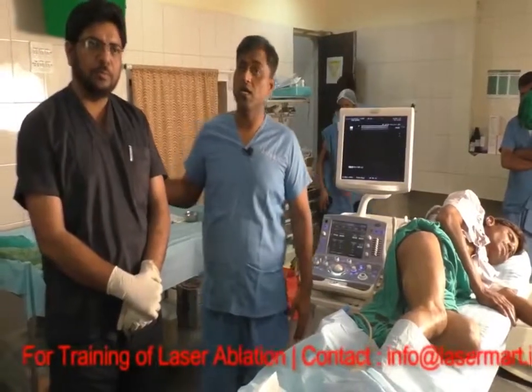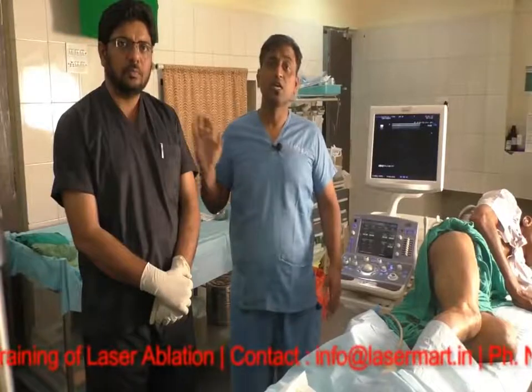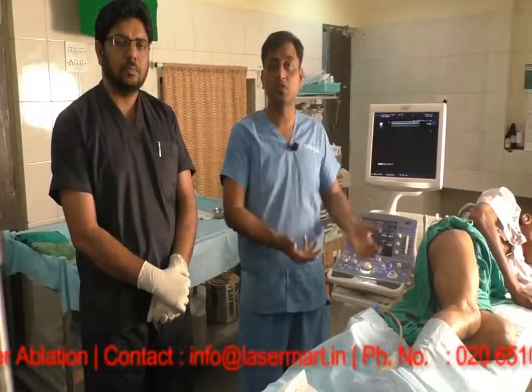Doctor Apurva Mahalle is my colleague and he is a pain management specialist. He looks after the femoral sciatic block, so he will explain you about the procedure. After that I will explain the endovenous laser ablation treatment.